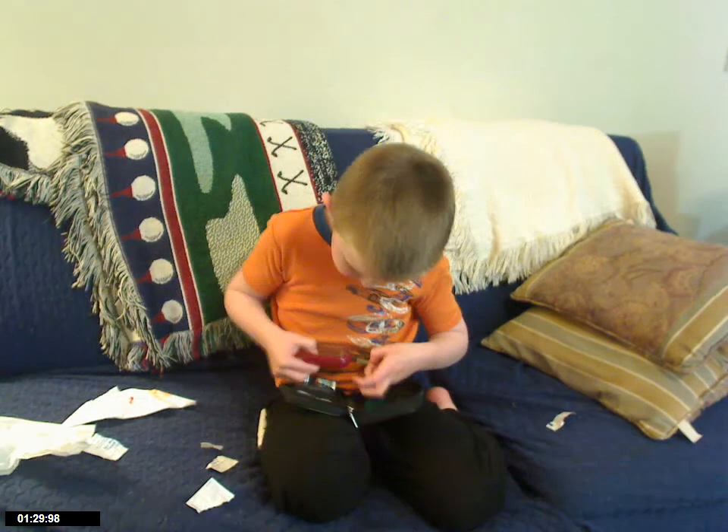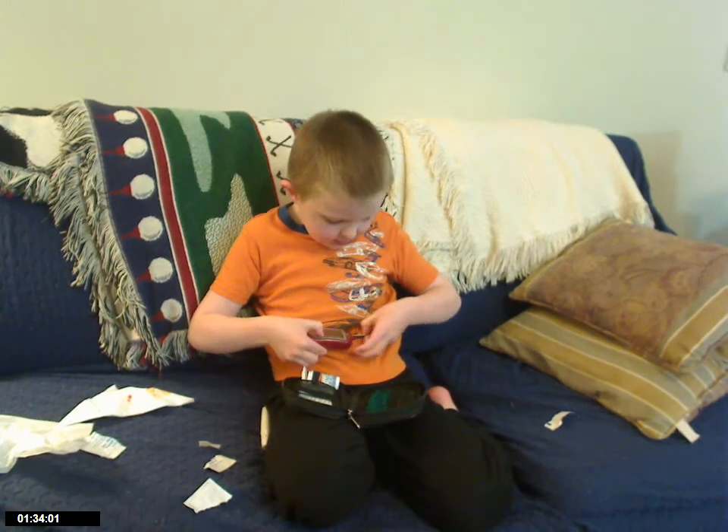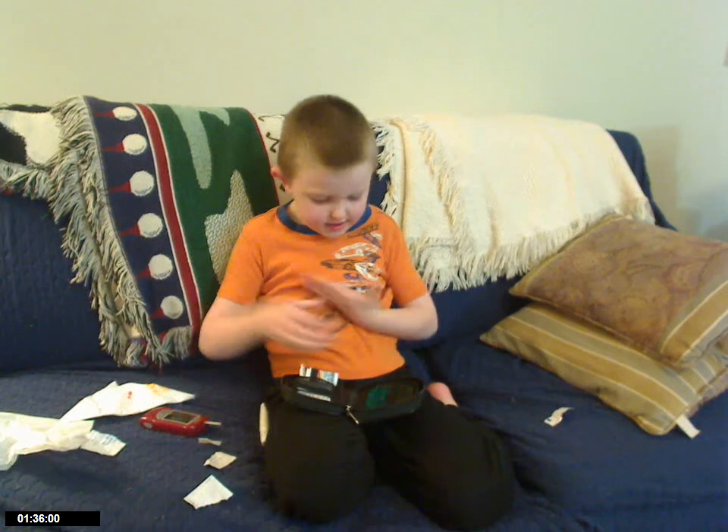Then we take the strip and put it in here — in the glucometer. In the glucometer?